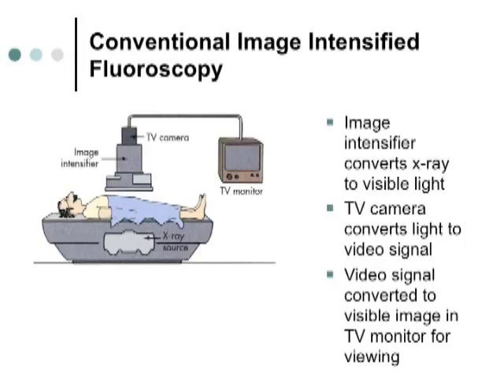That was done in complete darkness, right? They had turned all the lights off. Why? The light that was emitted from the fluoroscope was not very bright. It was very dim. You had to use your night vision to see it, which is not as good as our daylight vision. About 20/200 for night vision as compared to 20/20 for daylight vision. So radiologists were in the rooms with the patients for a longer period of time. The exams took longer. They got higher exposure levels.